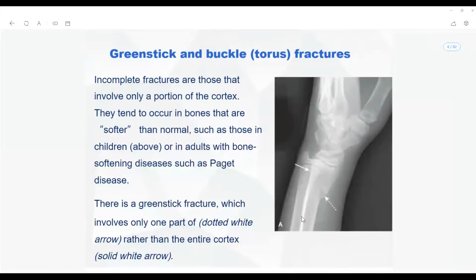You have to make sure that you understand this, because analysis of fracture radiology is the only way. Only X-rays are able to tell you how severe the fracture is. Without radiology, you cannot diagnose a fracture. So make sure that you learn these chapters very, very well for your clinical practice.